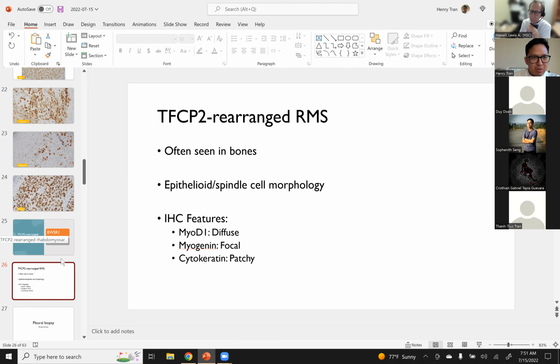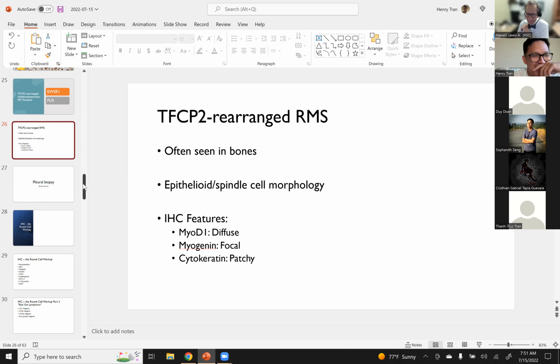Right. Any questions about this one? I'll just make a comment that I think your example here really nicely illustrates how even if you can't do the cytogenetics or the FISH testing or whatever molecular testing on this, if you understand the immunohistology, you can get strong clues with that understanding. I think that's really helpful. Yes, yes, and then Google helps too. Yes, Dr. Google. That's how I got to this diagnosis in the end.